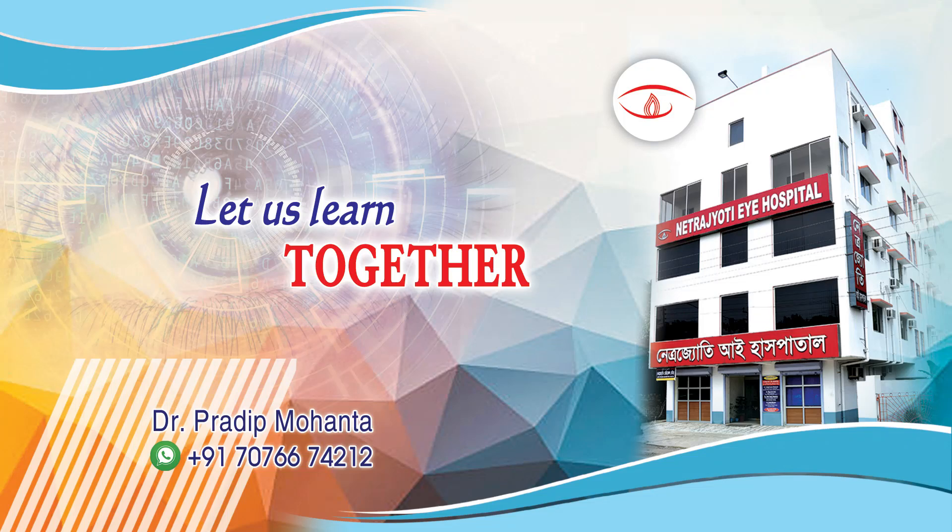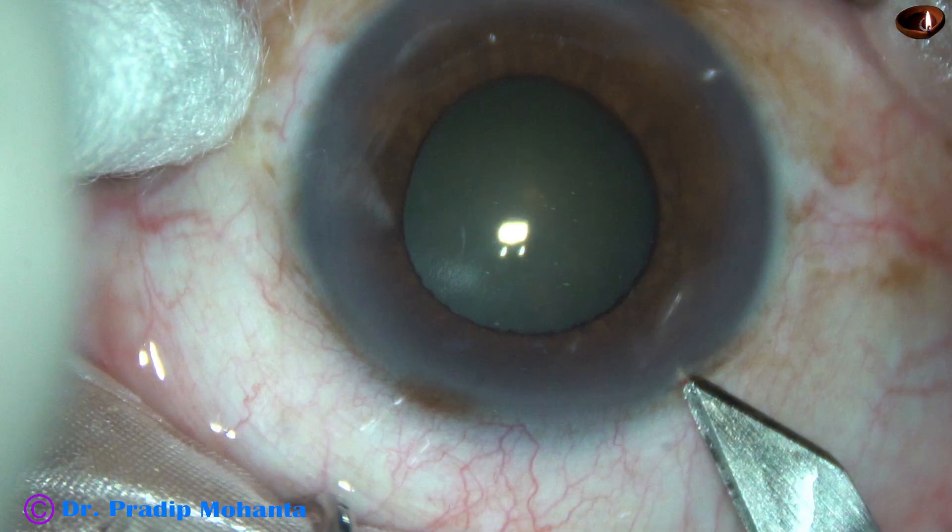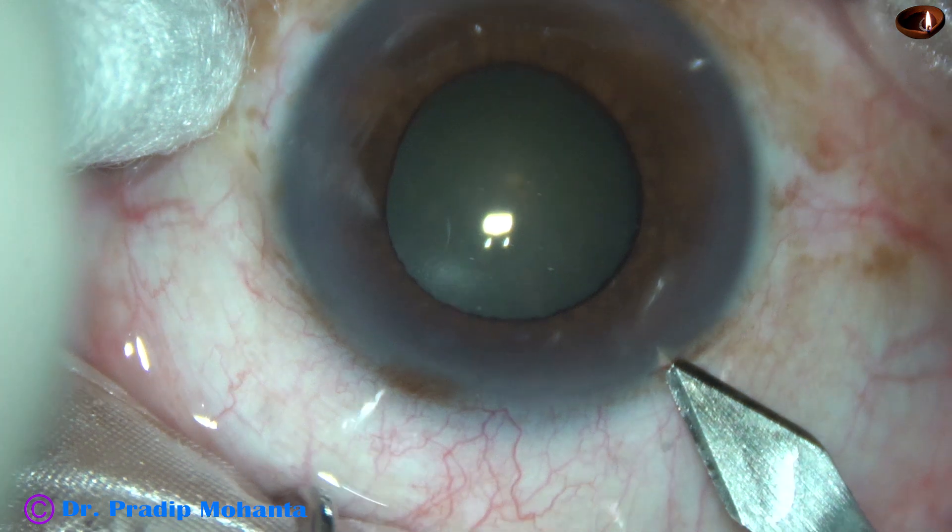Friends, welcome to my workplace at Ranaghat, West Bengal, India. This is a cataract with grade 2 plus nuclear sclerosis. Let us observe this surgery.